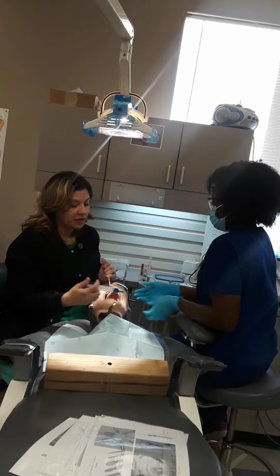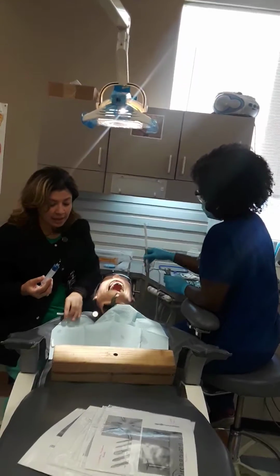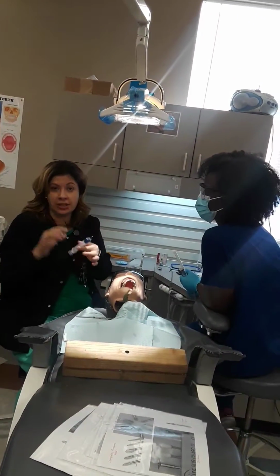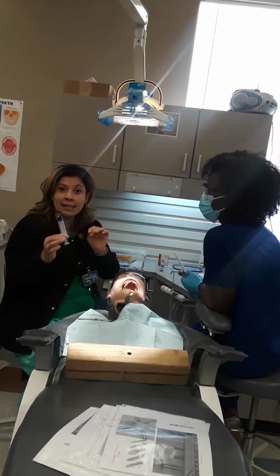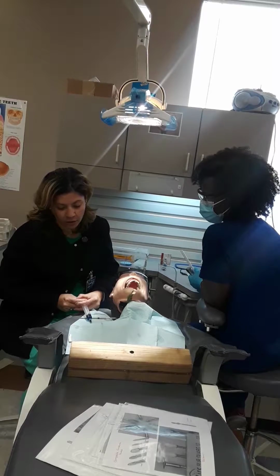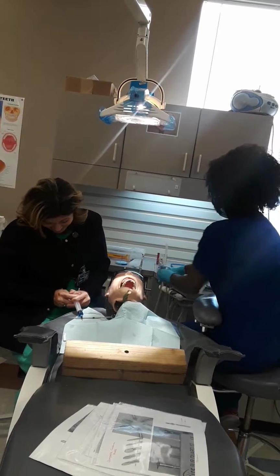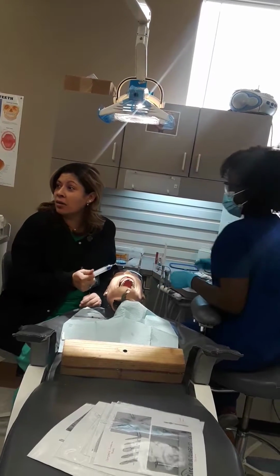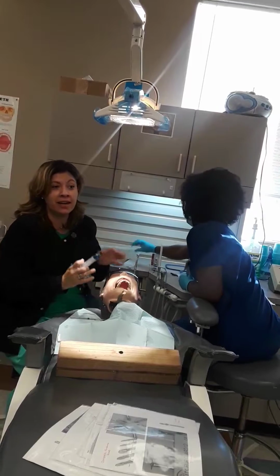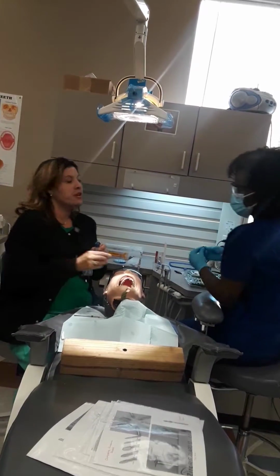Okay, this is phosphoric acid. Remember, as a great dental assistant, never pass the syringe, usually it's smaller, but never pass etch if it doesn't work. So always test before you give it, or before you sit down, glove up. See how I'm squeezing really hard? Nothing. My doctor's going to struggle. He's going to squeeze so hard, it might go all over the patient's face. Always check this etch before you pass it.